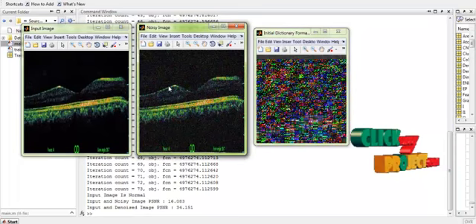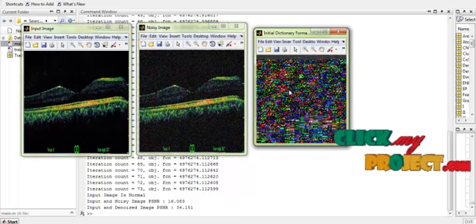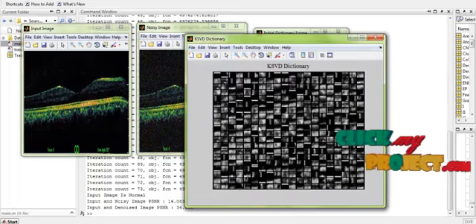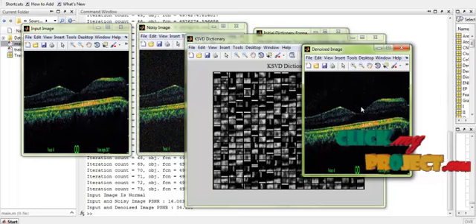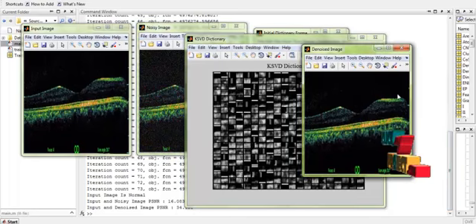The noise is added to the input image and the initial dictionary is generated for the identification of the noisy pixels in the image. This is the KSVD dictionary generated with which we identify the exact noises and remove the noises. This is the denoised image obtained. Thus, we have removed the noise added to the input image based on the KSVD denoising.